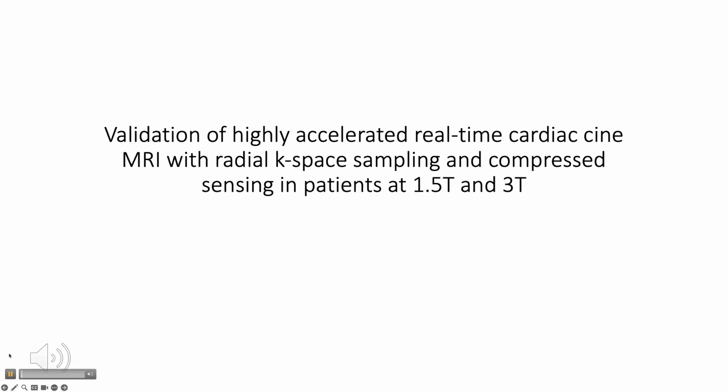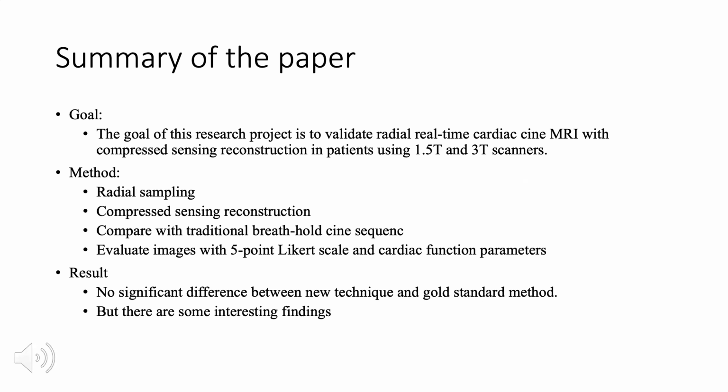Today, I'd like to discuss the validation of highly accelerated real-time cardiac cine MRI with radial k-space sampling and compressed sensing in patients at 1.5 Tesla and 3 Tesla. I'd like to start today's presentation with a quick overview of this paper. The goal of this research project is to validate radial real-time cardiac cine MRI with compressed sensing reconstruction in patients using 1.5 Tesla and then 3 Tesla scanners.